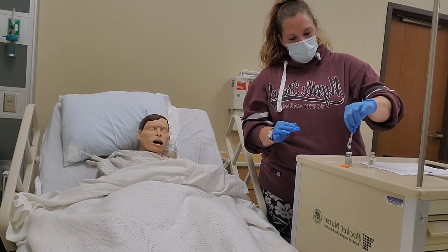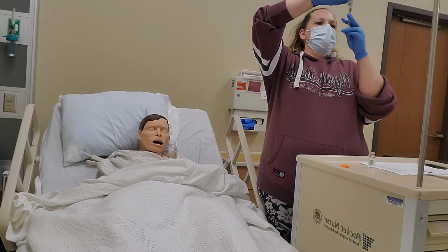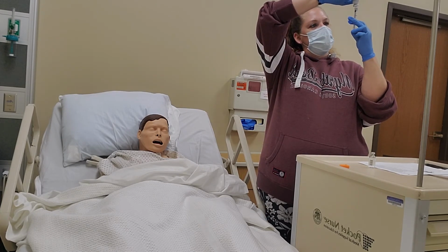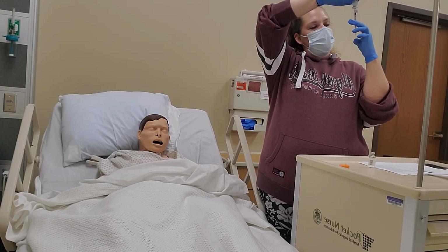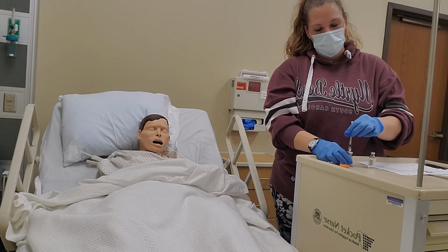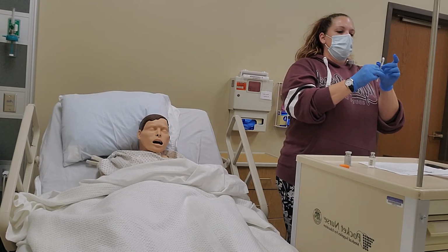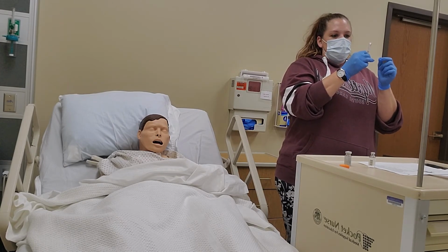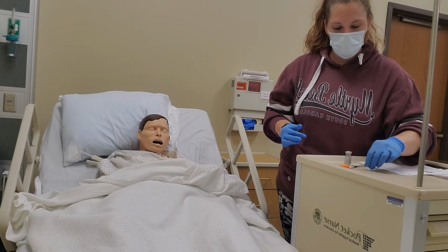Stick it in the NPH and then draw up 5 more. If you get too much, you'll just have to start over. Okay, and then I would have my nurse verify. No bubbles. Okay, now I'm gonna cap one hand.